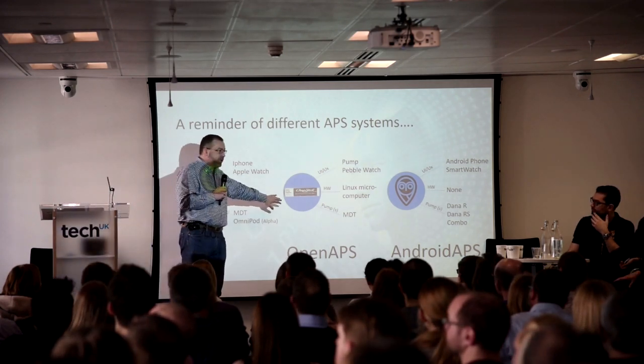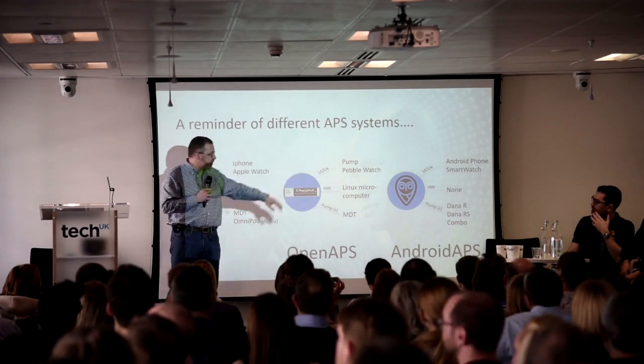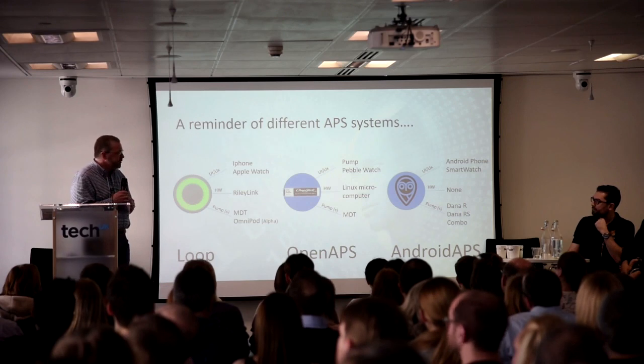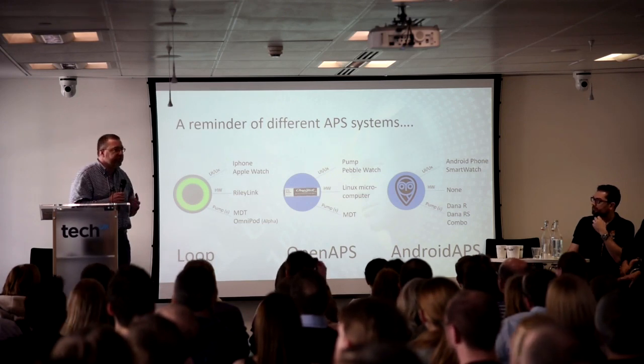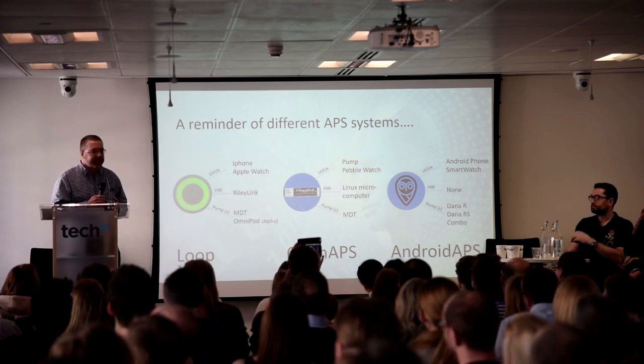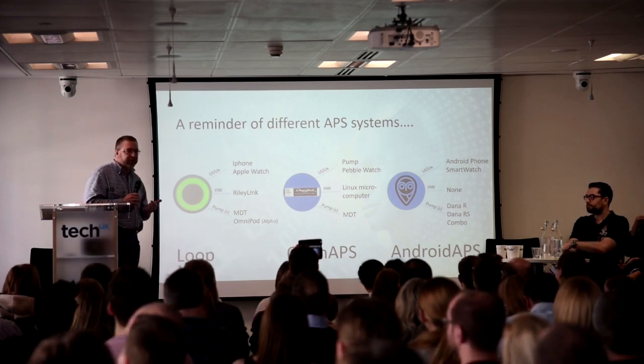Dana's already talked about OpenAPS. Gemma's already talked about Android APS. I think the big thing to note are the differences in pumps. A lot of this started out in the US around Medtronic pumps. You're seeing with Android APS the ability to use the Dana R and RS.